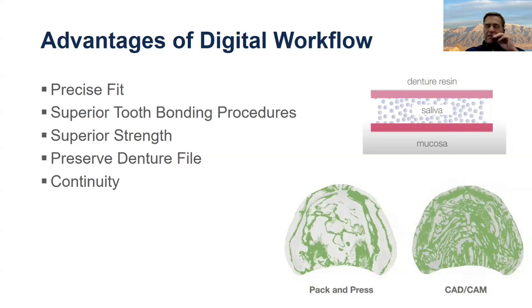I would recommend also, when you get the STLs, make sure that you record what kind of material was used. This is a fast evolving field, and that way your lab will be aware of what processes need to be done with the STLs if you decide you need to replace a missing denture or something like that.